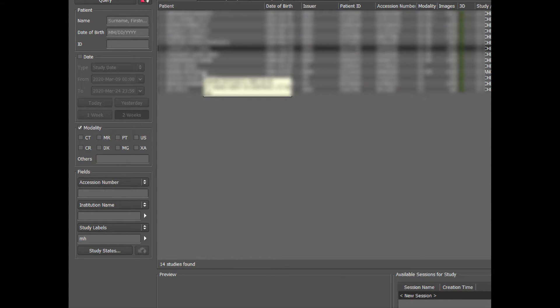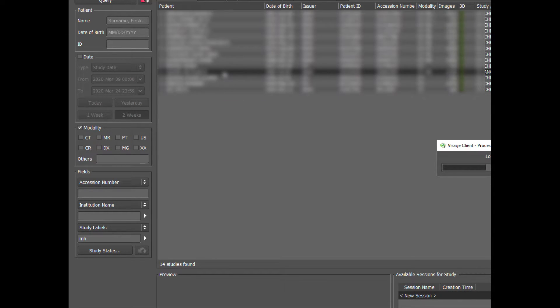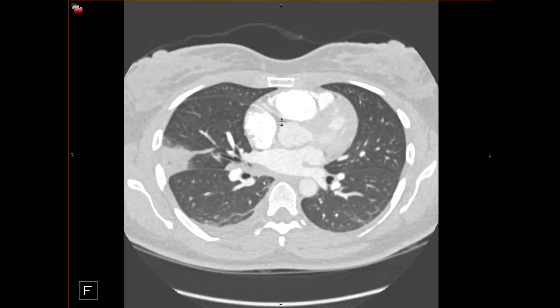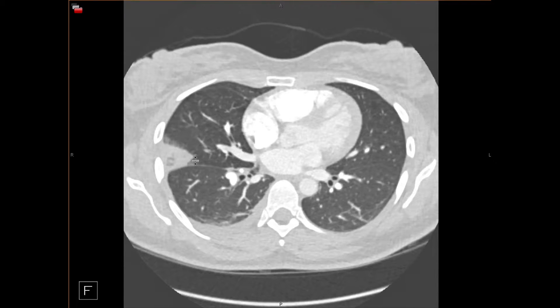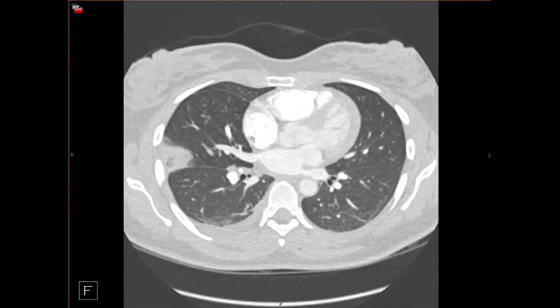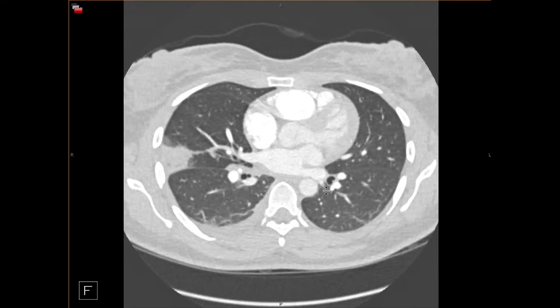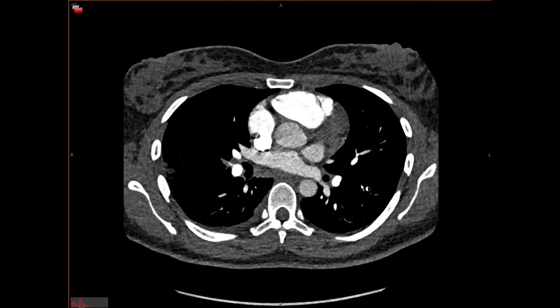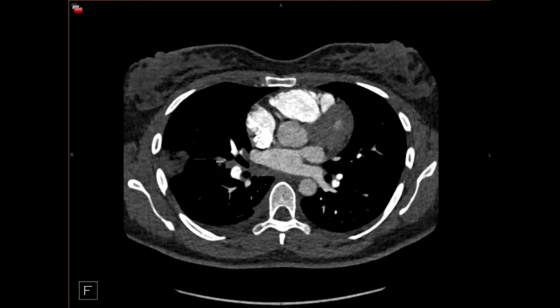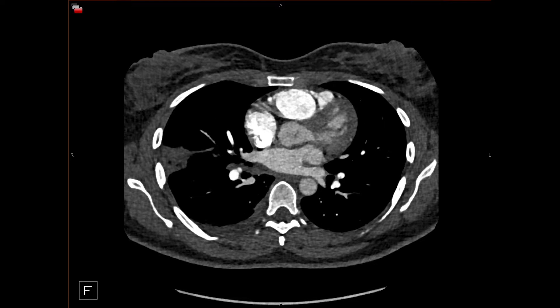The second important entity to consider when you see a reverse halo sign is pulmonary infarct. In the right middle lobe, we see a triangular peripheral area of consolidation with central ground glass clearing. Notice the triangular and peripheral shape — you should always think about pulmonary infarct with this distribution, whereas many organizing pneumonia cases are more central. We can see there is an embolus in the artery to the lateral segment of the right middle lobe, confirming pulmonary infarct.